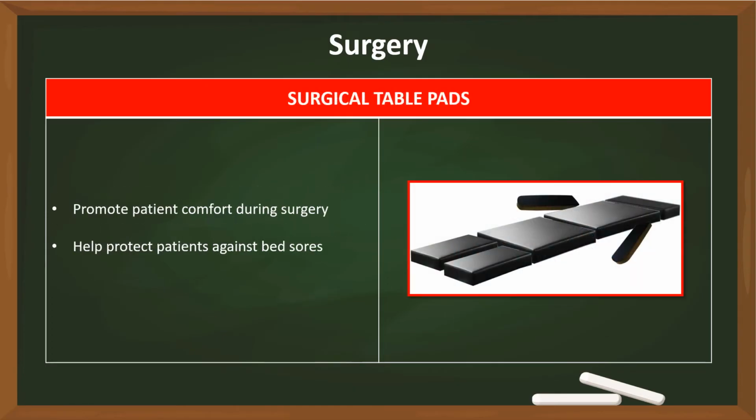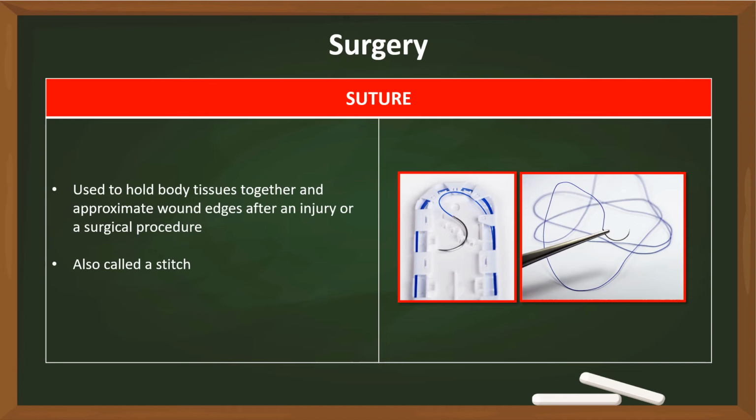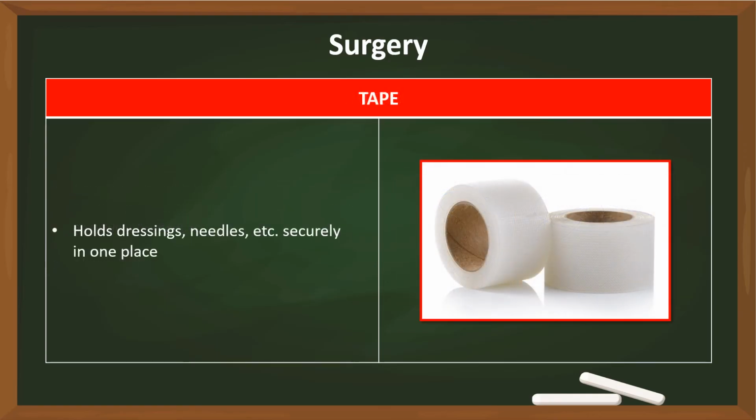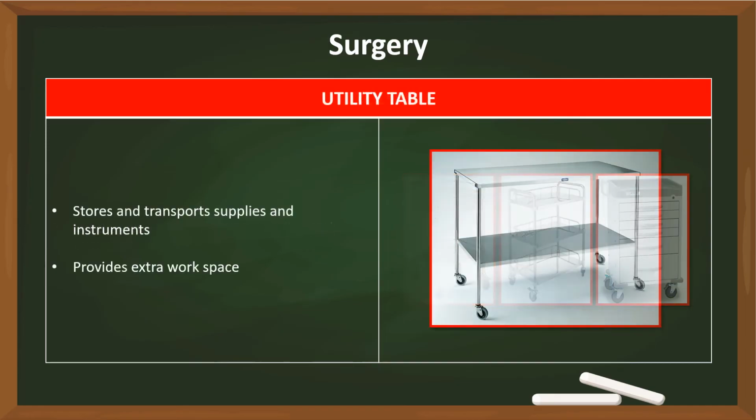Surgical table pads. Suture. Tape. Trolley. Utility table.